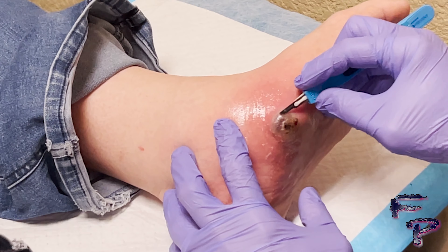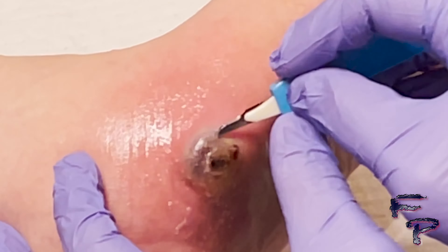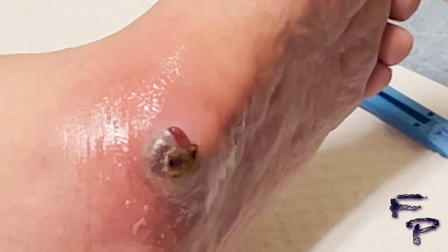In this case, an incision and drainage will be performed. A small incision is made along the corner of the blister, decompressing the blister. Immediate purulent drainage is noted and cultures will be taken.